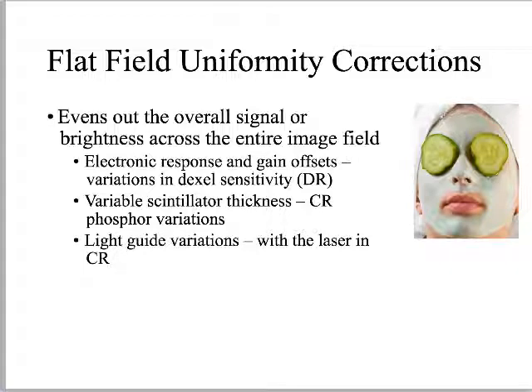So that's what we're talking about when we talk about these flat field uniformity corrections. And I don't know, the makeup parallel that I've got is like one of these facial type things, right? Or like for me in high school, it was those awful acne medicines that I had to put on my pimples to make them go away. So anything to get the oil off of your skin, that's like a flat field uniformity correction. So we want to get rid of all the pimples, right?